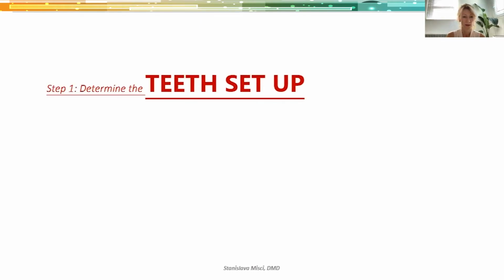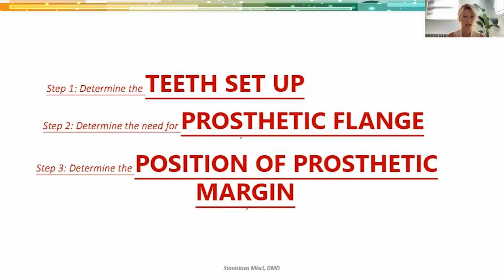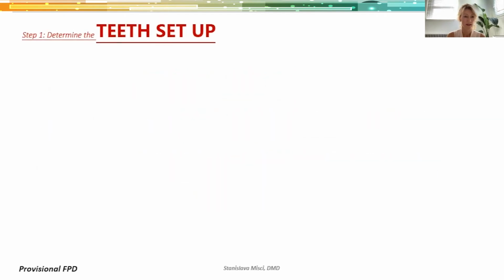So again, the 3 steps for me, the 3 check marks I want to have are the tooth setup, the prosthetic flange, and the position of the prosthetic margin. So let's look at some cases and we'll go over that for every case.